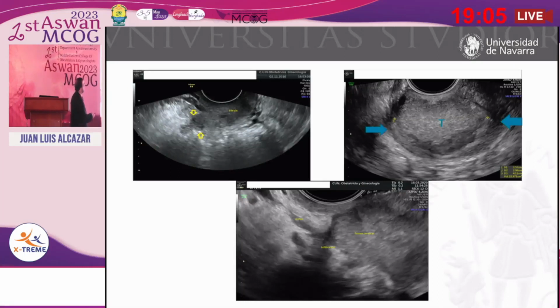Here you have a transverse view of a cervix with a tumor, and the tumor is extending into the right parametria here. Same here. This is the ureter, and the tumor is very close to the ureter. This tumor is reaching the pelvic side wall. However, in this case, you see the tumor here, and when you look at the parametrium, there is no infiltration. The parametrium is very well defined. Remember, this is a transverse view of the cervix.